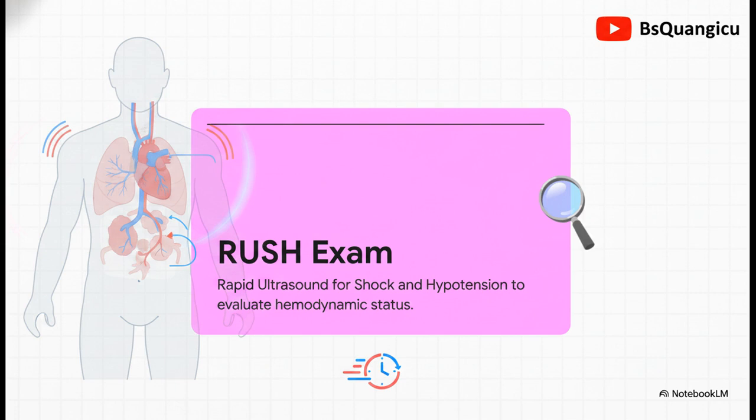Well, enter the RUSH exam. That stands for Rapid Ultrasound for Shock and Hypotension. First rolled out back in 2006, this protocol is a total game changer. It's built specifically to let you evaluate a patient's hemodynamic status right there at the bedside. Once you get the hang of it, it's the ultimate time saver.